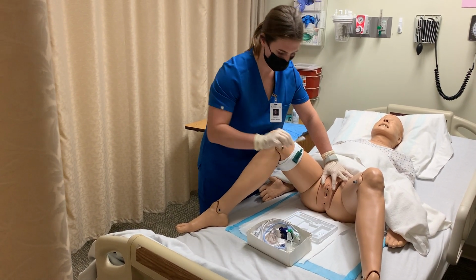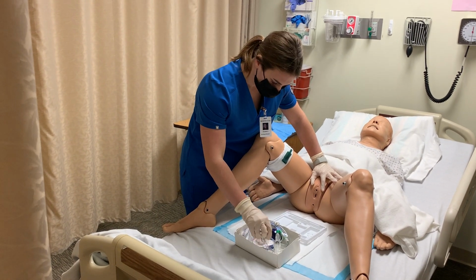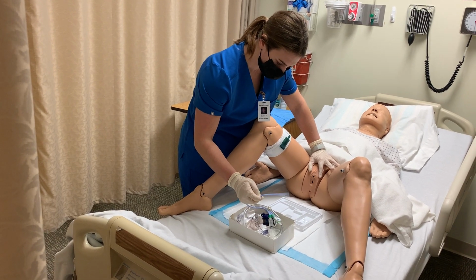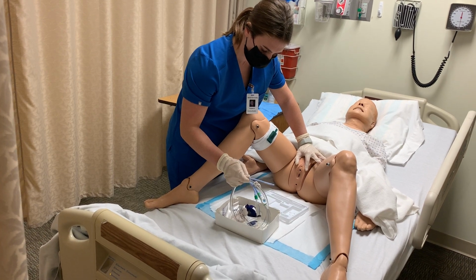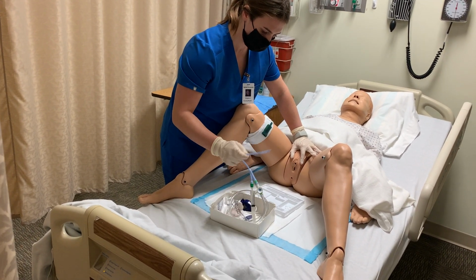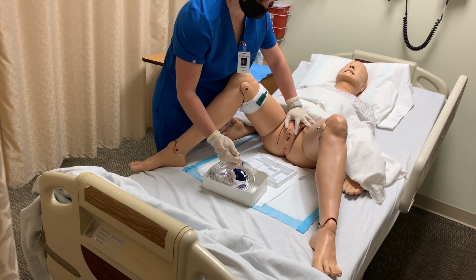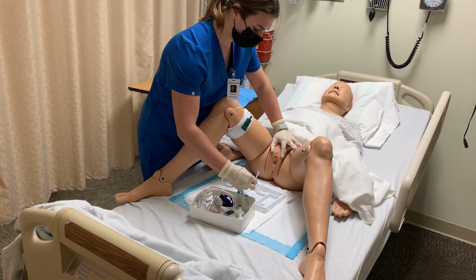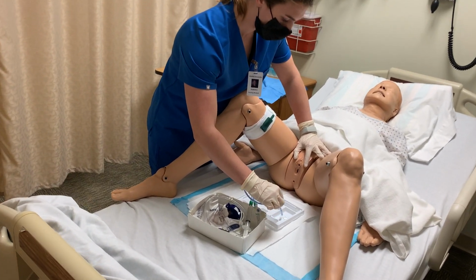Now we're going to go ahead and put some lube on the last couple of inches of the tubing.